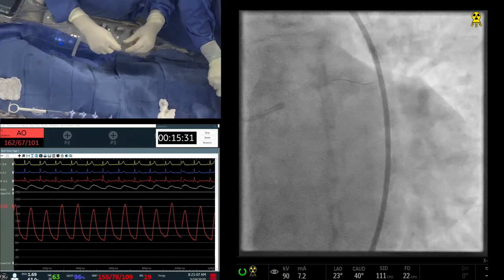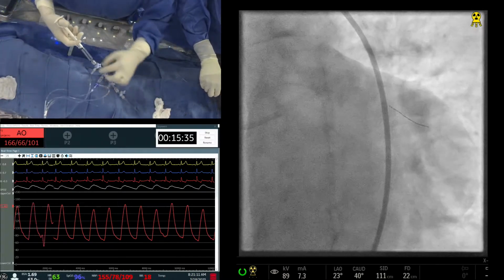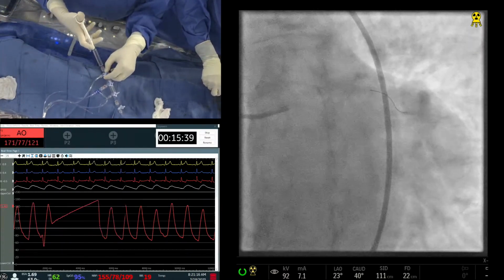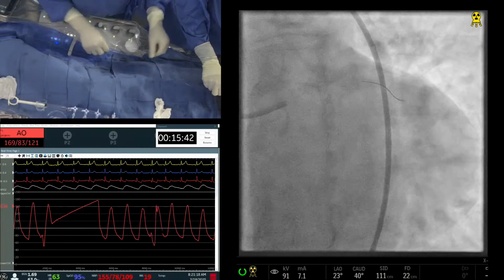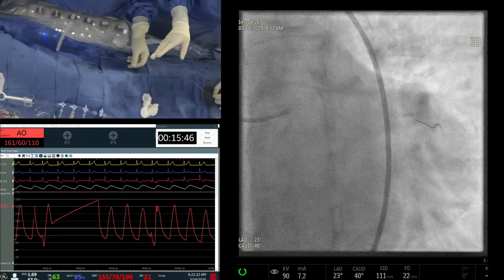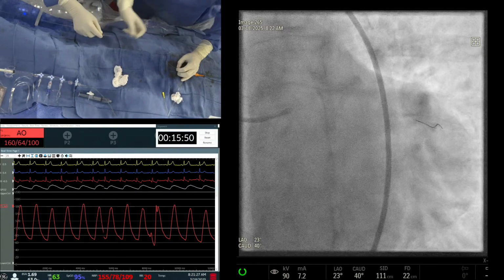Good. I think it may be that this branch is, okay, let's just see. One second. It's on the top branch. Let's select it. It has to make a turn. Should I take this bar out? No, let's go. You want me to take this clip and use the clip as a torquer if you need? You're still good on the top one. Okay, it's okay.